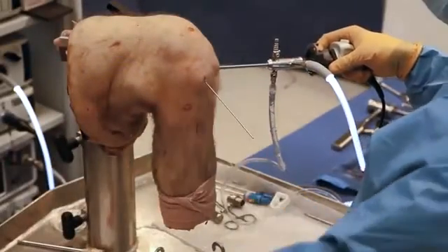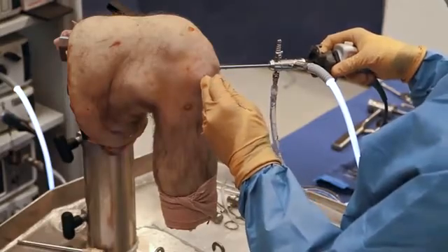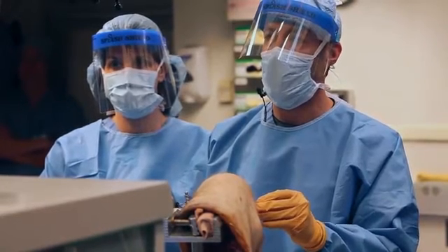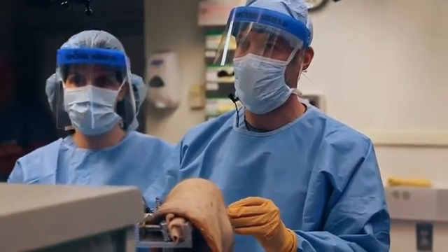We're going to be talking about femoral tunnel positioning today. Dr. Steve Howell, Dr. David McAllister, and I have come up with an acronym to describe our optimal tunnel position, and that acronym is IDEAL.